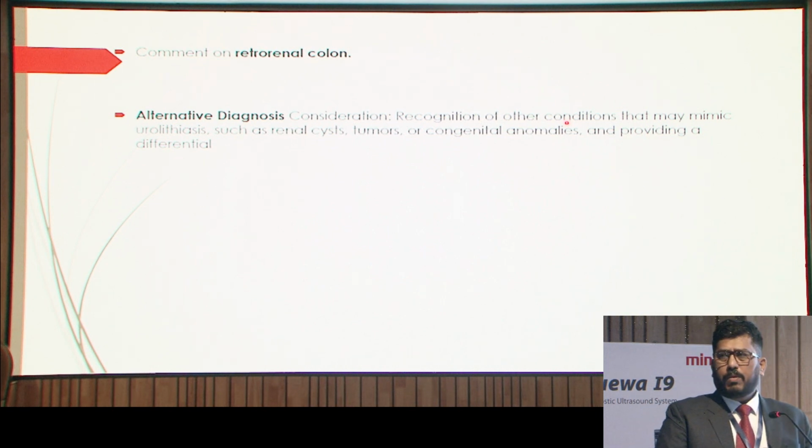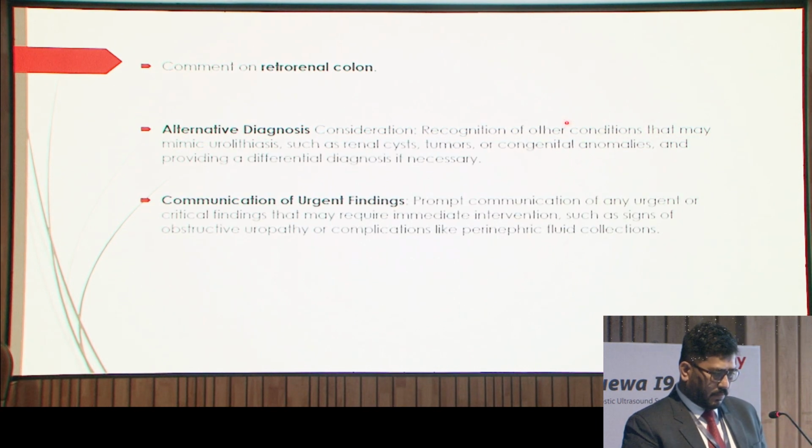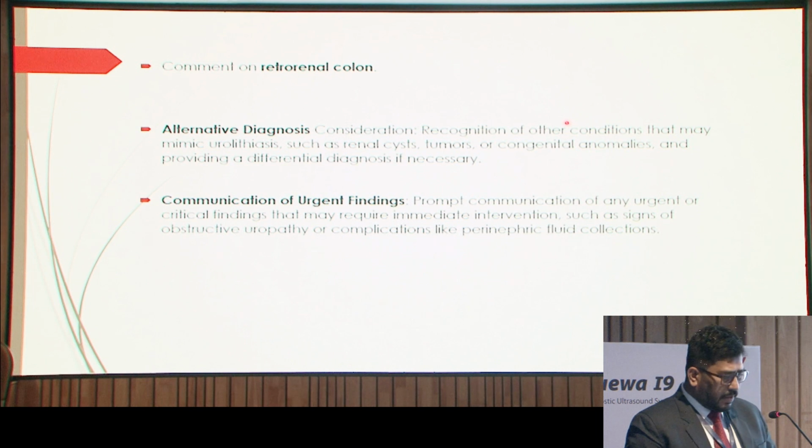Again, one more point I just wanted to differ, that Dr. Nikita said 5 mm cuts should be there. I think it should be 2 mm cuts, because in 5 mm cuts we can definitely miss a small stone. Then communicating again with the urologist is important.